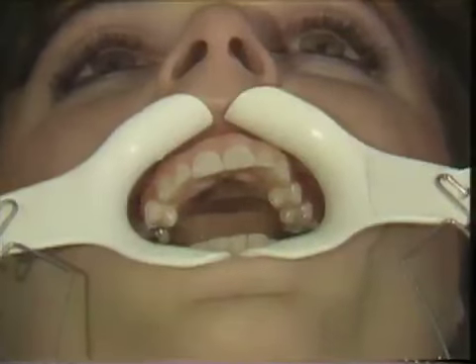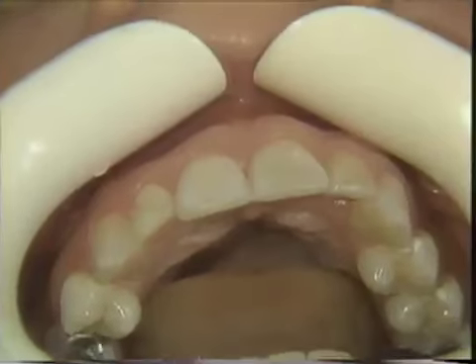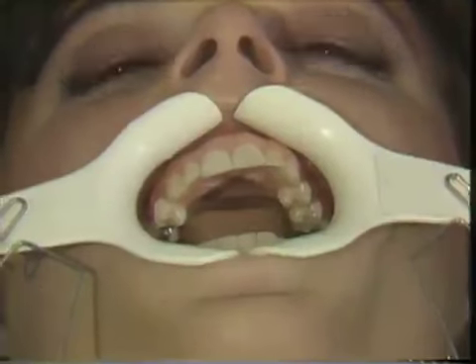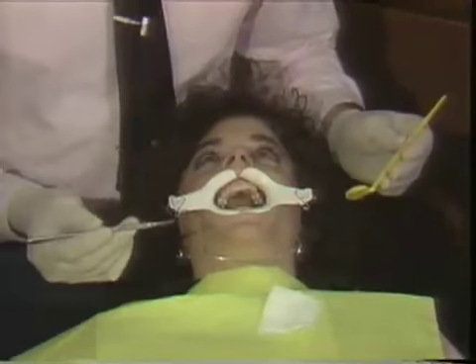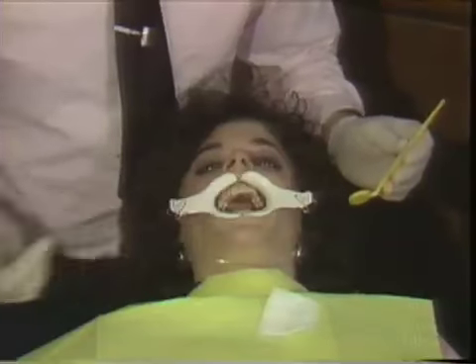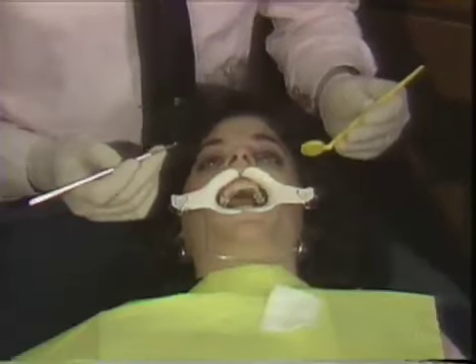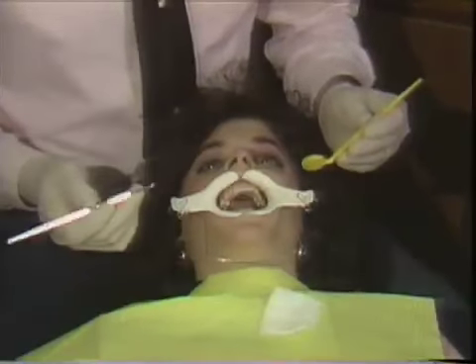And then it's the sandwiching of that layer of paste between the two layers of primer that gives us the polymerization. Now in the placement of the brackets, I have found that the most convenient and efficient way of carrying out this procedure is to have in my hand, on the upper arch anyway, a mirror and what is in fact a gold foil knife, which is perfectly adapted to the placement of a bracket on a tooth. Now Liz will then place the one-step adhesive on the bracket and then place the bracket approximately in position on the tooth.